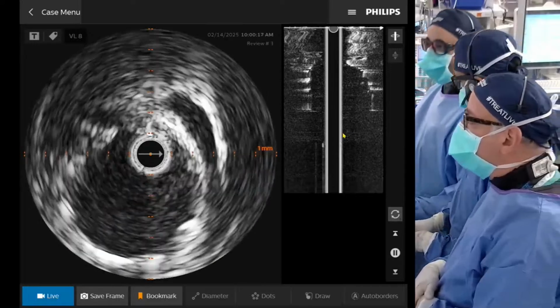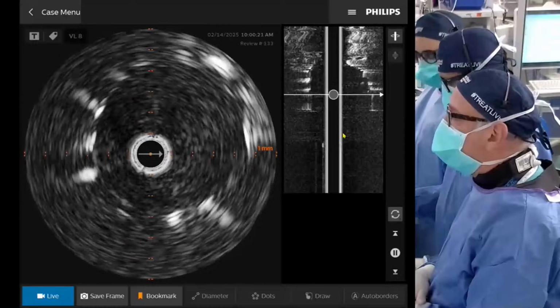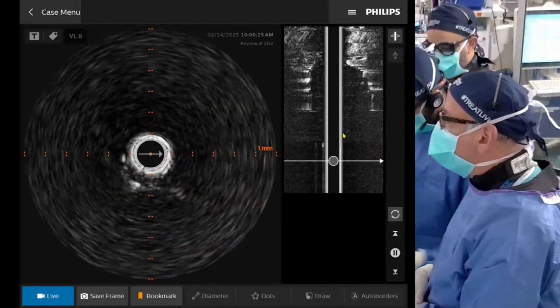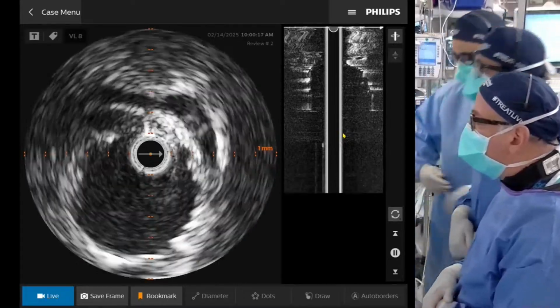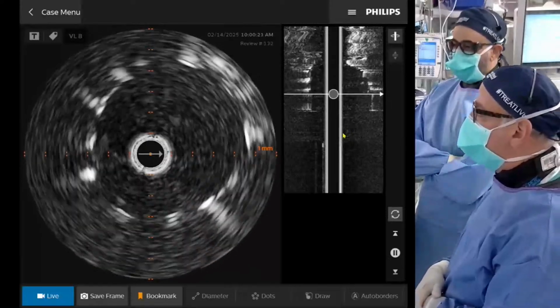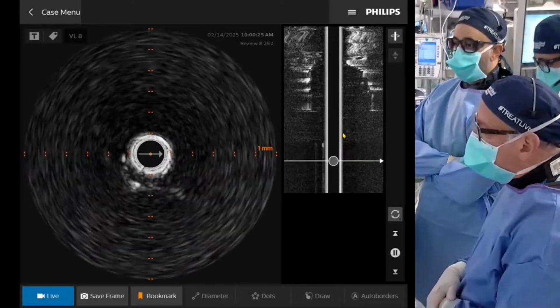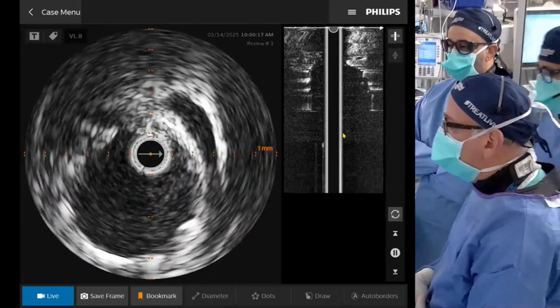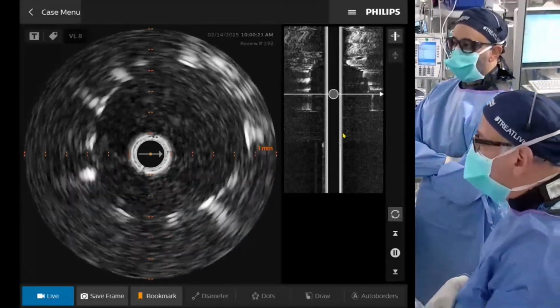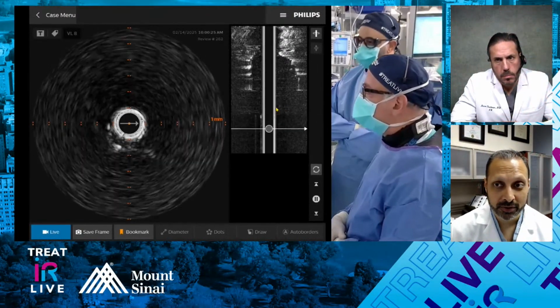Parag, I'm just going to throw this out as a closing question. I think you saw in our initial diagnostic angiogram, we probably have 2 or 3 millimeter accessory renal arteries going to the lower poles on both sides. Do you have any comments or experience revascularizing those small renal arteries? Should we interrogate them, angioplasty them? We do have 2.5 millimeter coronary stents. Any thoughts about that?